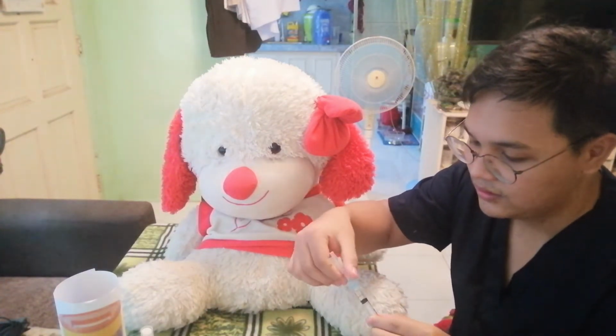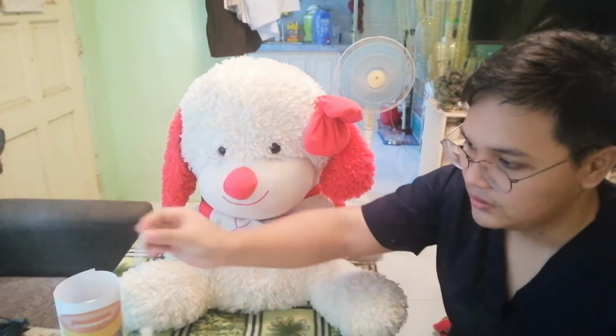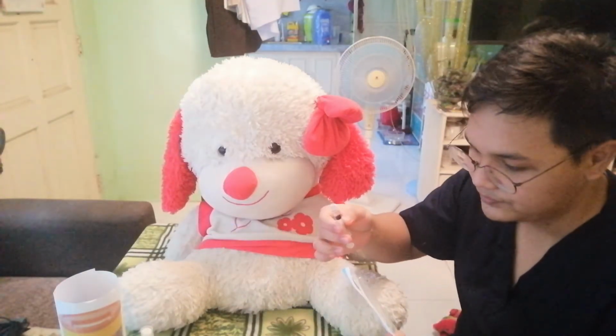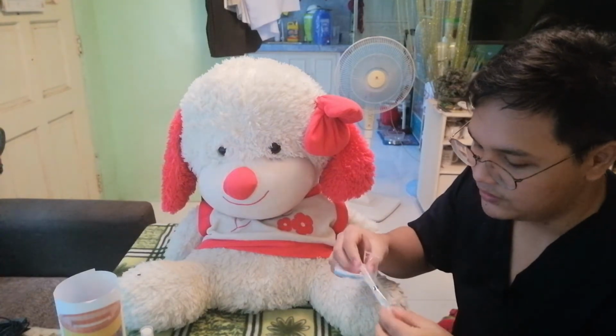Okay, so we'll now be covering it, and we need to switch it now to our normal needle. So we have discarded our filter needle to the sharps container or the appropriate receptacle for sharps. Okay, now that our medication is prepared, we will move it aside first. So we are now done with performing our hand hygiene. We will now proceed to our next step, which is we need to prepare our client.